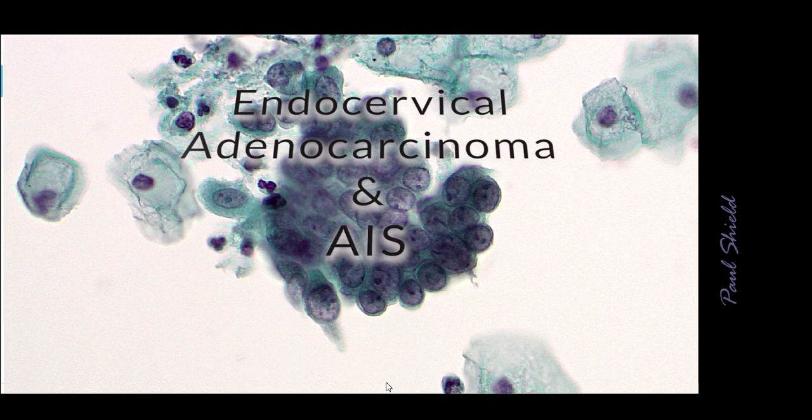Hi, it's Paul, and in this clip I'm going to look at glandular lesions of the cervix. So that is invasive endocervical adenocarcinoma and also adeno in situ. Considering the two together because I think the distinction is a difficult one and probably a little subtle for us at this stage.